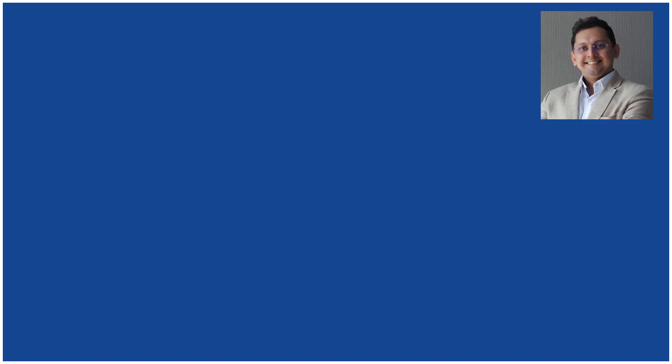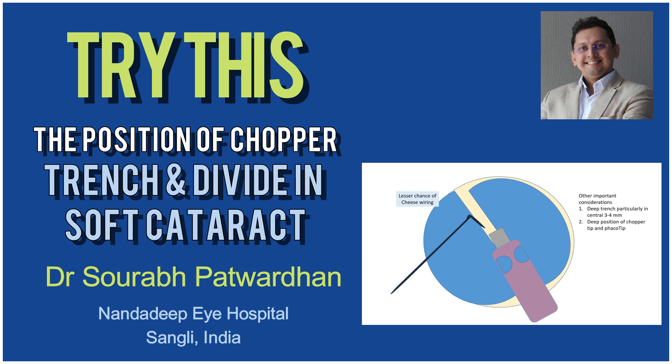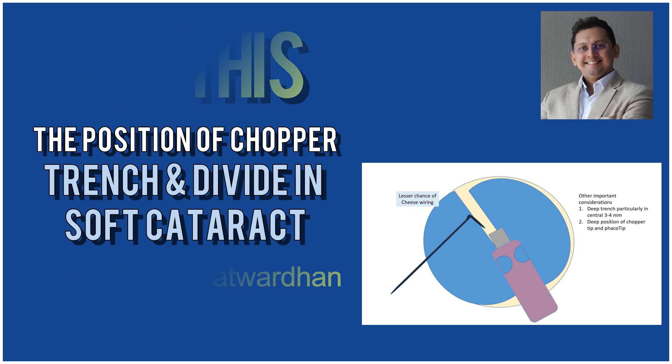In this video, I am going to describe the position of the chopper when you are doing trench and divide, particularly in soft cataract, and how it is useful for getting a perfect division in case of a soft cataract.